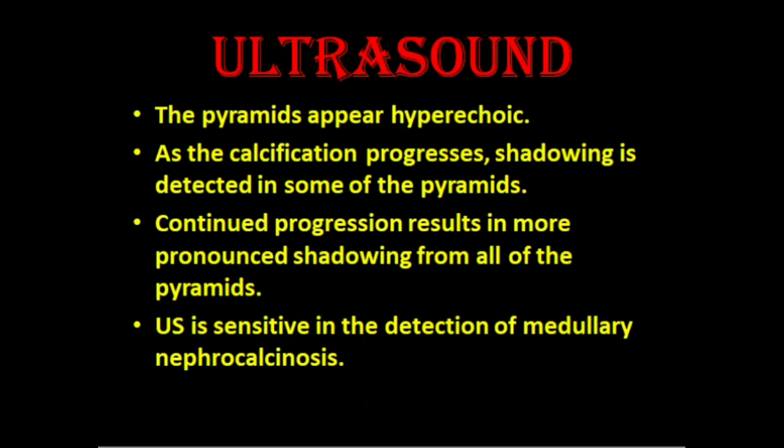The ultrasound of nephrocalcinosis will show that the pyramids are hyperechoic. If the calcification progresses, shadowing is detected in some of the pyramids, and if progression continues, it results in more pronounced shadowing from all of the pyramids.